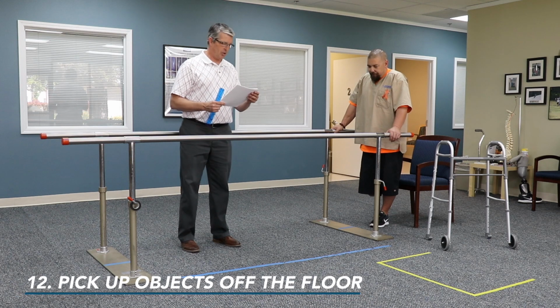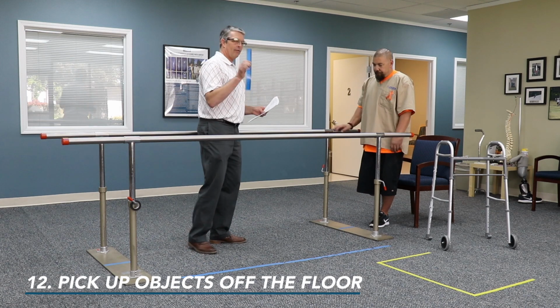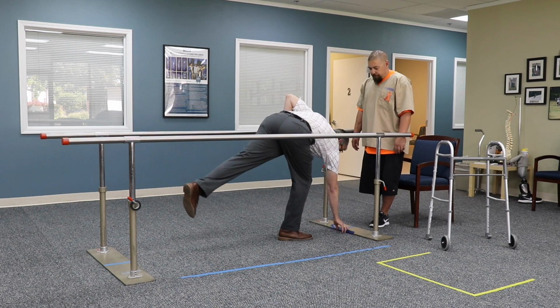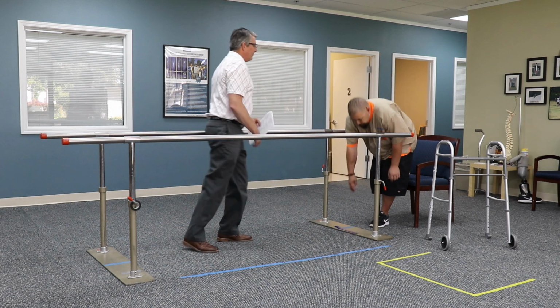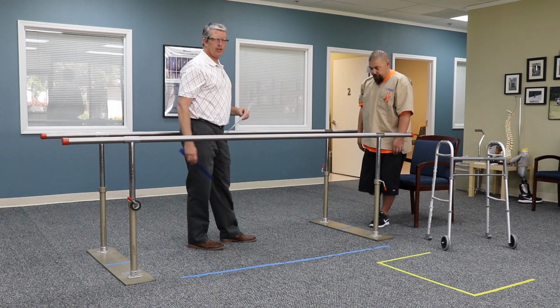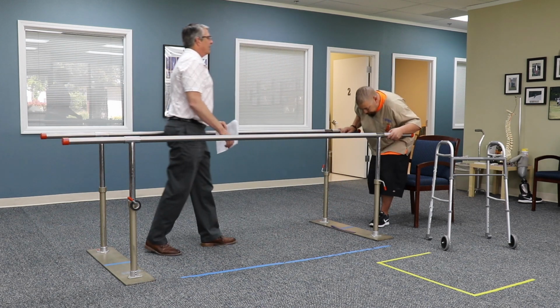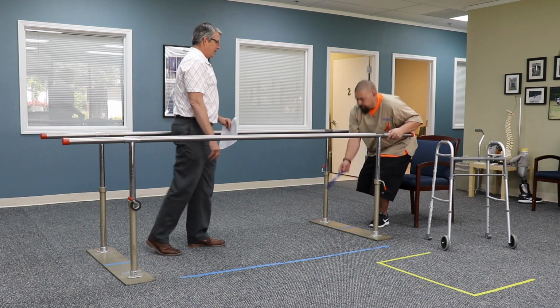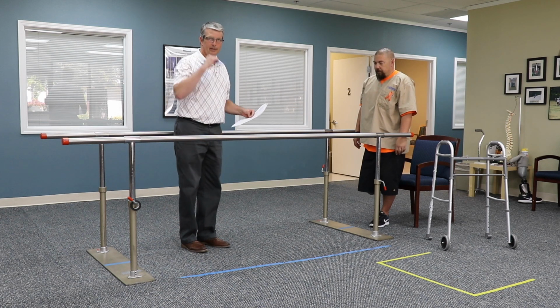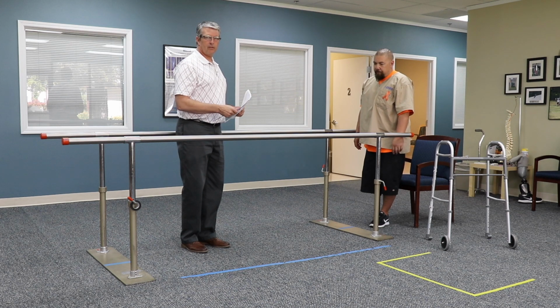All right, we're going to move on to number 12, picking up an object off the floor. Okay, so you want to have a ruler or something, you want it about a foot away from their toes. Okay, in this case, put that right there. Very successful in doing that, even without his prosthesis on. Not everybody's going to be able to do that. Okay. Needed the parallel bars to accomplish that. Had a little bit more squat going on in his leg. So that would knock him down to a 1 with those assistive devices being used.